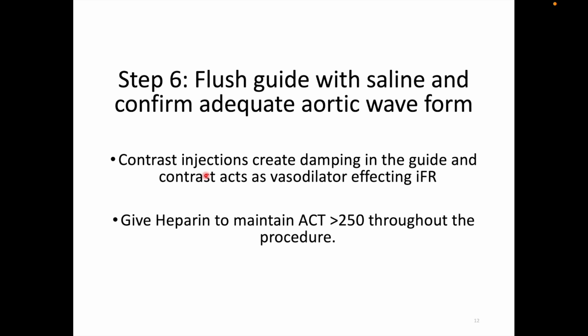So give heparin to maintain an ACT of more than 250 seconds throughout the procedure. So no more contrast injections. You've got a roadmap in front of you without taking further contrast.